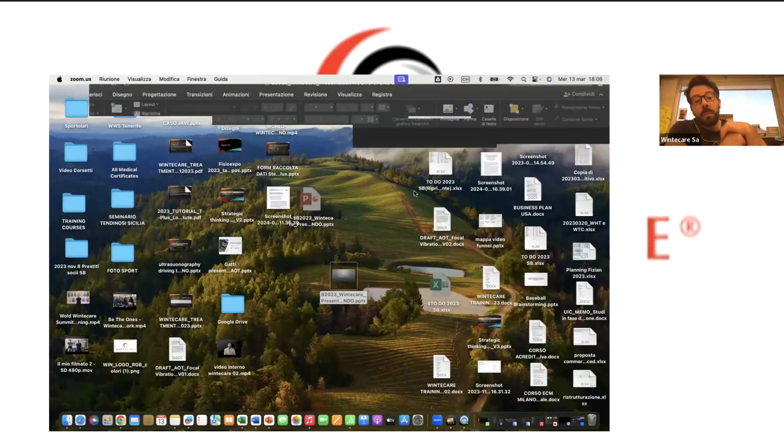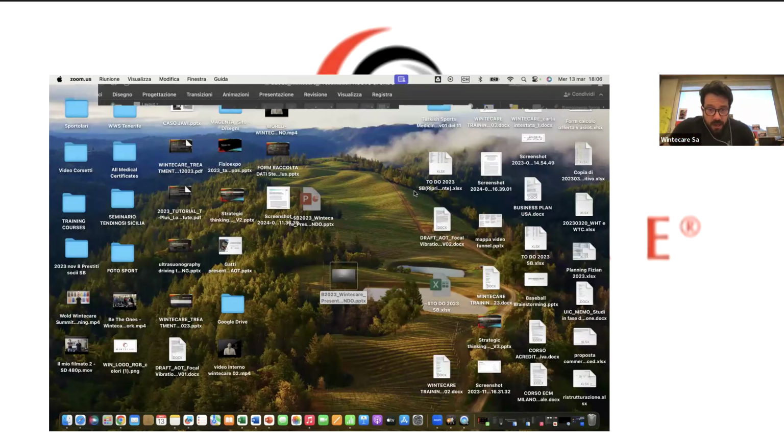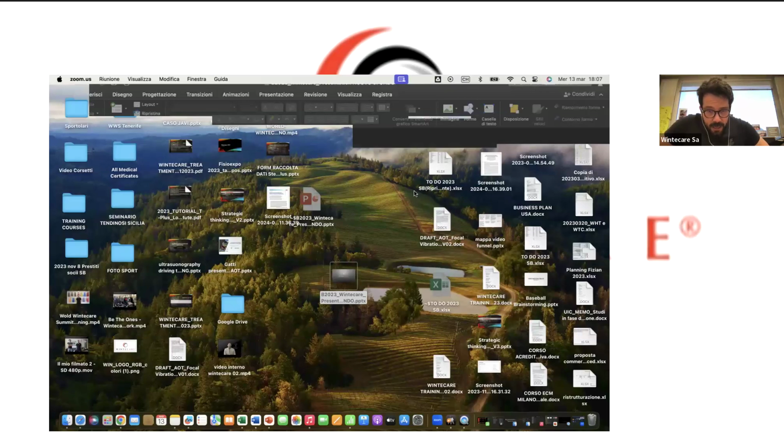Not to forget, it would be good to work also on the iliopsoas. So when you have some hip dysfunction, it would always be good to work on the iliopsoas in order to release it, especially if you see that the patient has shortening, so some symptomatic effect with a short diaphragm, short abdomen muscles. In that case, this would help to create space and release a little bit of tension on the column level.